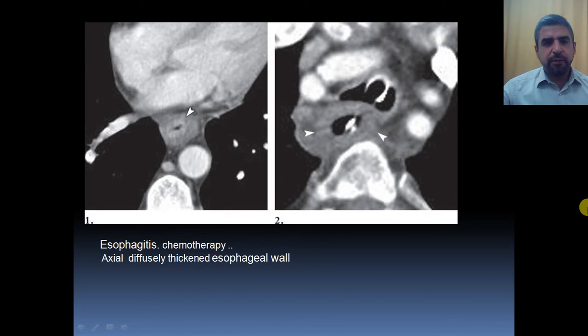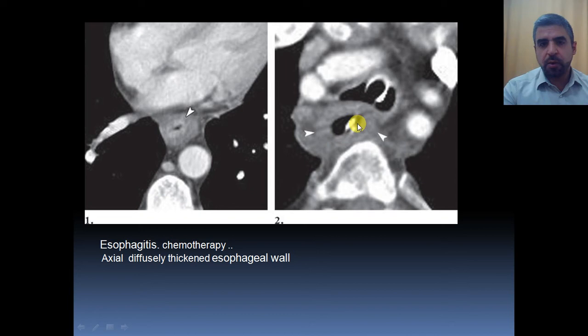For example, you can see here the esophagus of a patient suffering from esophagitis post-chemotherapy, showing markedly thickened wall and thick enhancing mucosa as a result of inflammation. Another case of esophagitis shows the marked wall thickening and mucosal enhancement or increased attenuation.